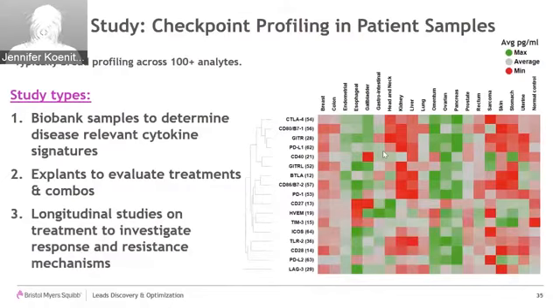So the heat map exemplifies an example of what such data could look like. This aggregates several hundred serum samples by different tumor types, which shows clear differences in the checkpoint molecules detected. Ultimately, the goal is to build a sufficiently large database that allows us to identify predictive biomarker signatures when linked to patient phenotypic or treatment data.